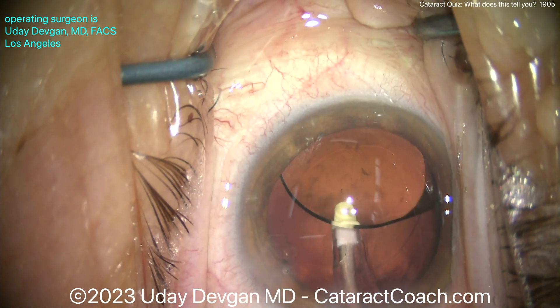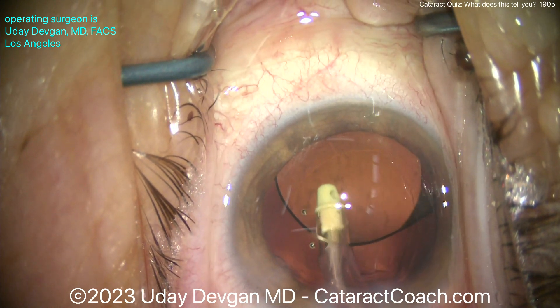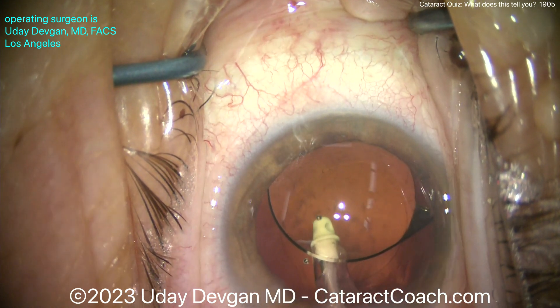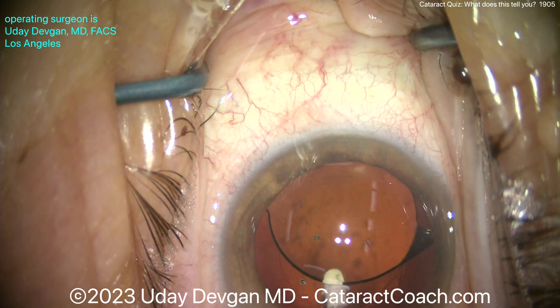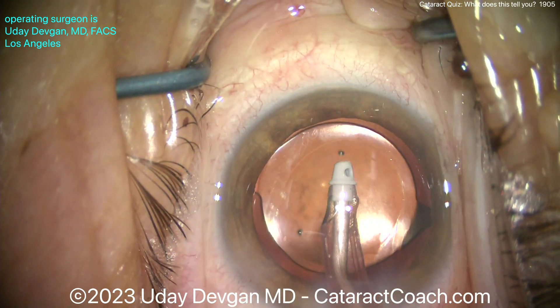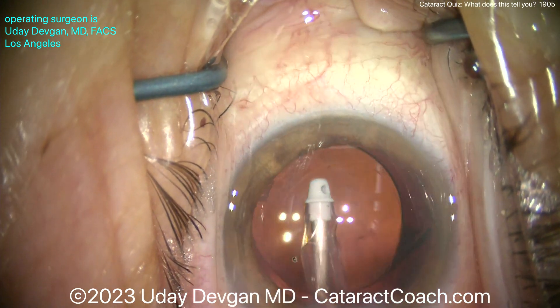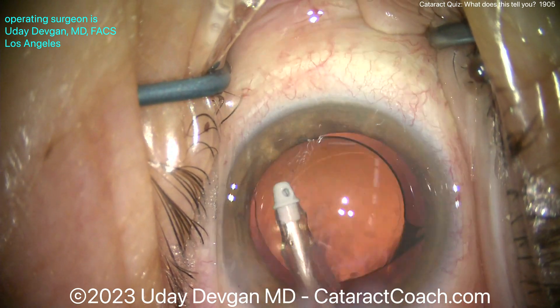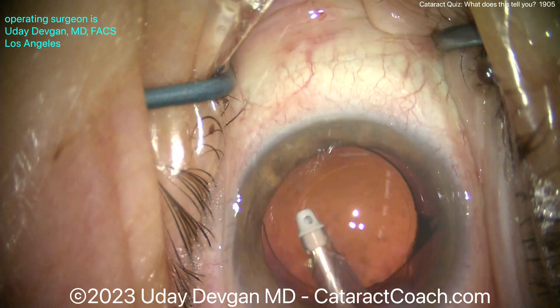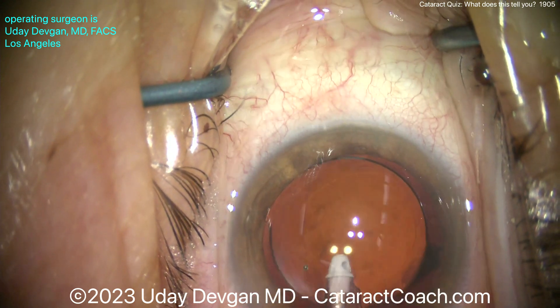Going behind the IOL to remove viscoelastic — look behind the posterior capsule. What do you see? There are little tiny bits of lens fragment. Those went through the area of zonular loss — through that gap — while we were breaking up the cataract and emulsifying it. You're not going to be able to get those out very easily, so my advice is to leave them alone. They're not going to cause much issue; there may be a little more inflammation in the post-op period, but they'll melt away in that inflammatory cascade.